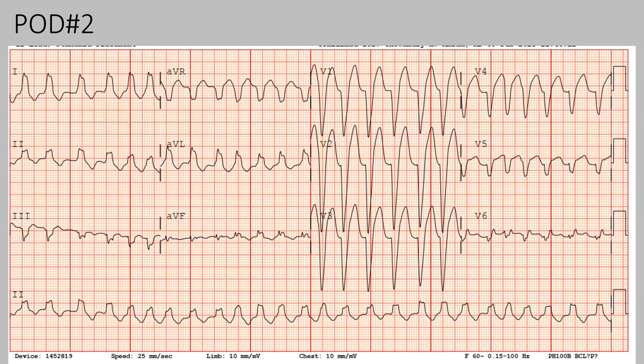And what is he on right now, any medications? Is this the first time AFib was discovered? Yeah. But the patient has a left bundle from before, so it was not a problem, you can compare. So the rate went up and then sinus became AFib. So what medications to give to control the rate? What is the ejection fraction? 20%. And is it post-op or just a while after bypass? A few days out.